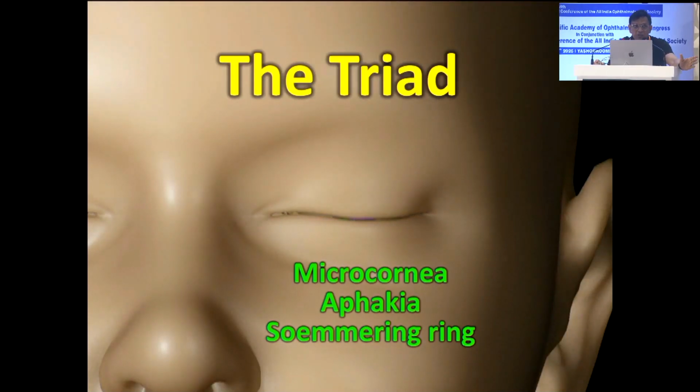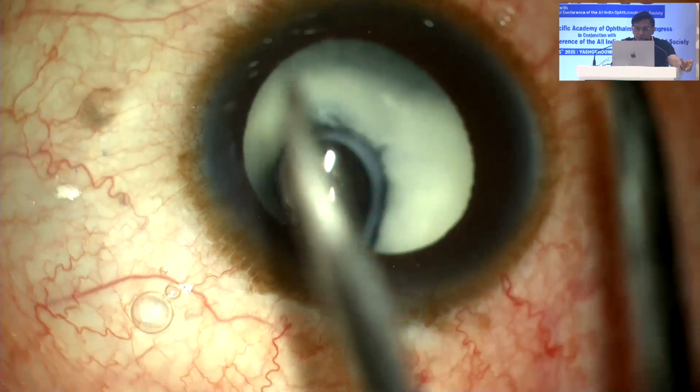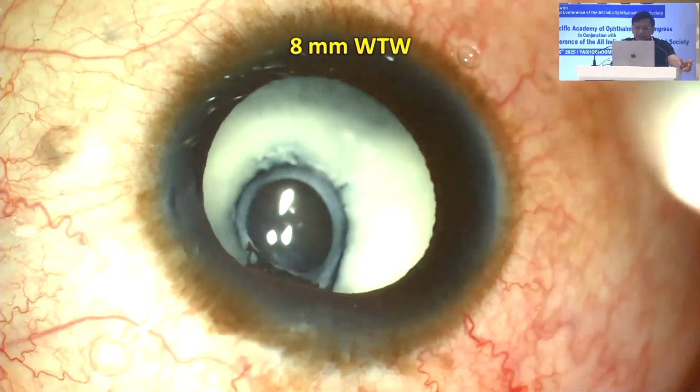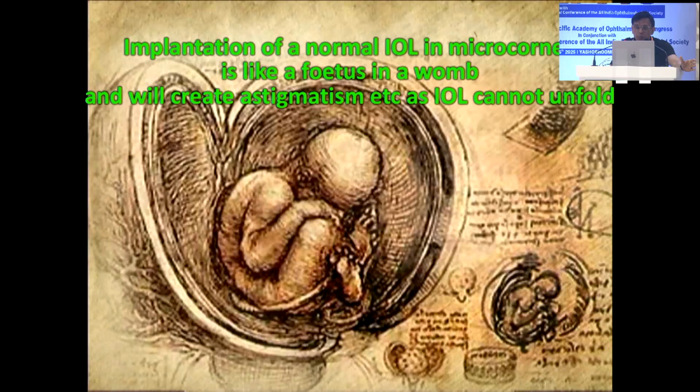Why am I specifying all this about microcornea? Take this particular case, it has 3 problems in the patient. Now measure the white to white. Look at that, it's about 8 millimeters white to white. The point I'm making is, if you put a normal IOL, let's say there's no PCR, even if you put it in the bag, it's a foldable of about 12.5, or even if you put a 13 millimeter lens, it becomes crumpled up. It's like a fetus in a womb.